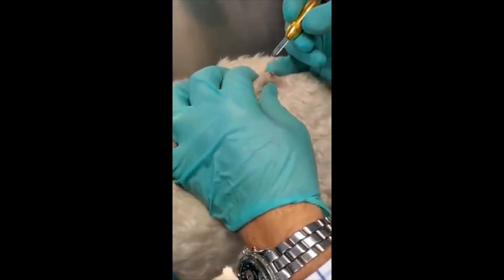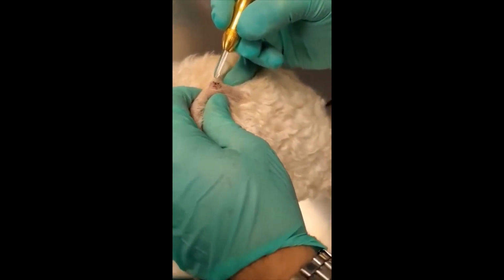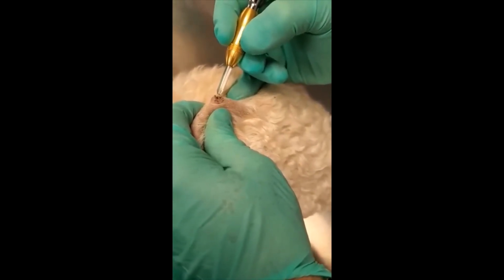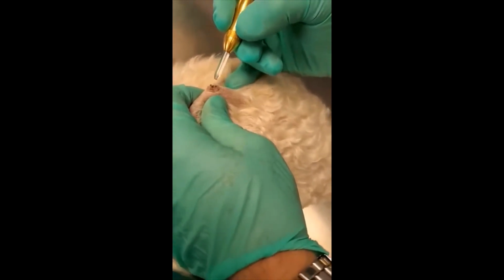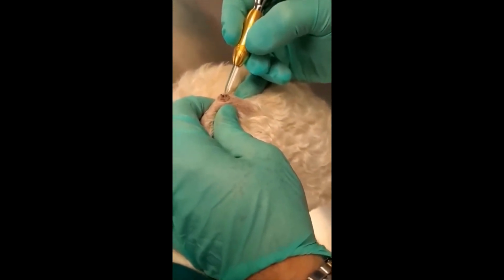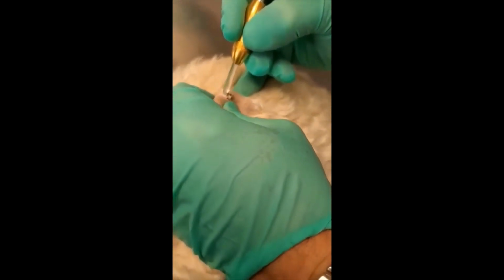We're going to one by one freeze these with approximately a 30-second freeze cycle, thaw cycle, and a freeze cycle again for 30 seconds. Remember, we want to make sure that we're knocking any material off of the surface so that we get good contact and quick freezing. We don't want any ice crystals building up, preventing contact. So we're going to freeze this for 30 seconds.